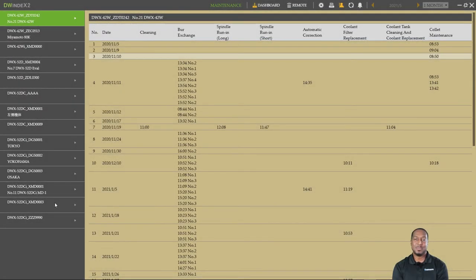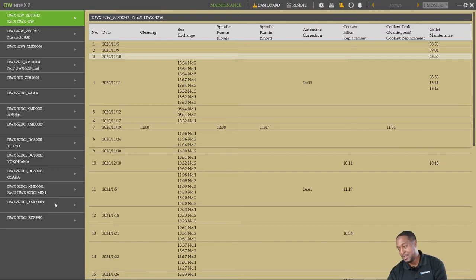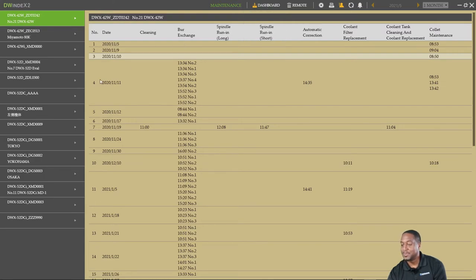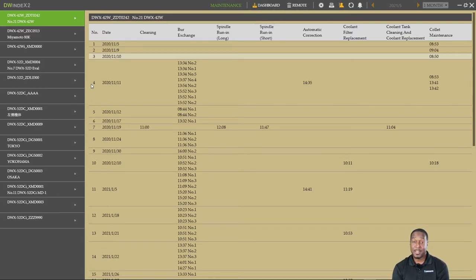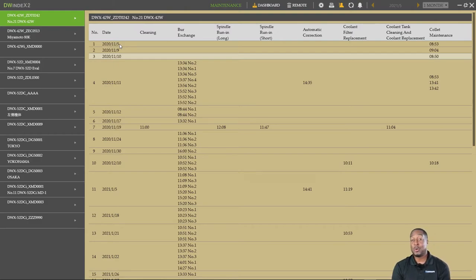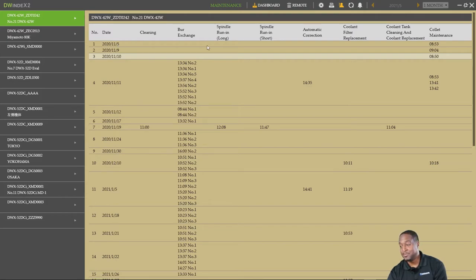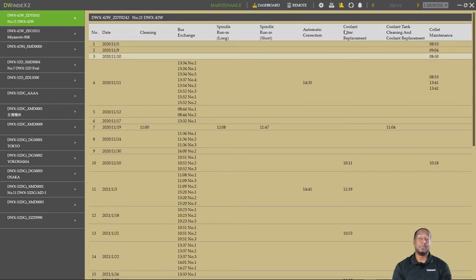The Maintenance Dashboard keeps a list of all completed maintenance operations for each connected milling device. To access this dashboard, hover over the Dashboard menu and click on Maintenance. On the left side, you'll see all your connected milling devices. In the main portion of the screen, you'll see a list of each completed maintenance operation according to date and time. Based on which machine you are viewing, your menu will change based on the operations that can be performed for that mill.